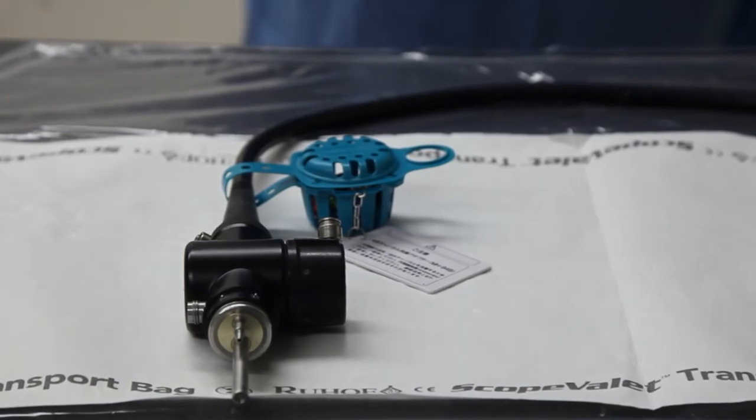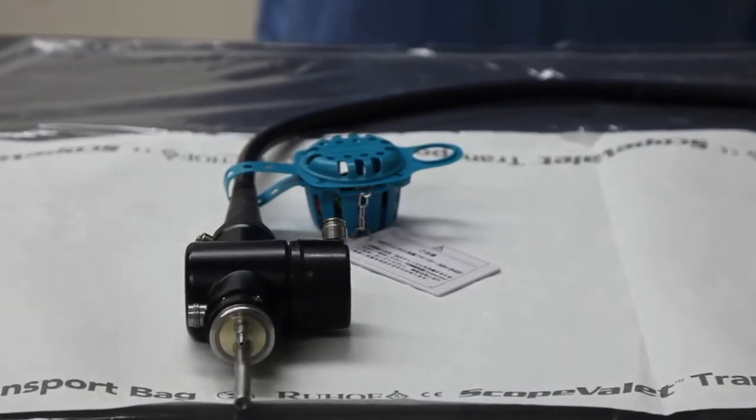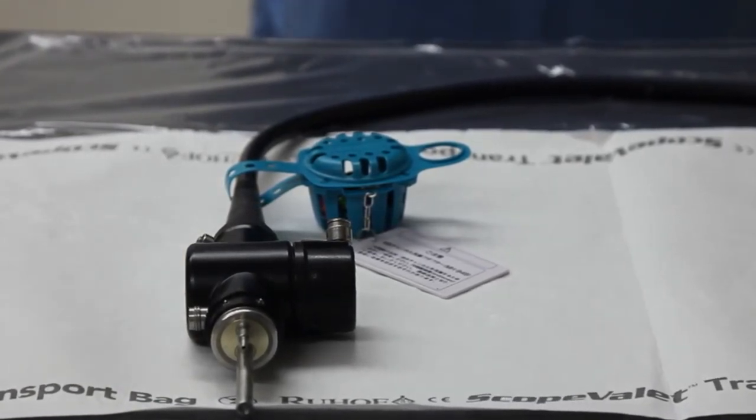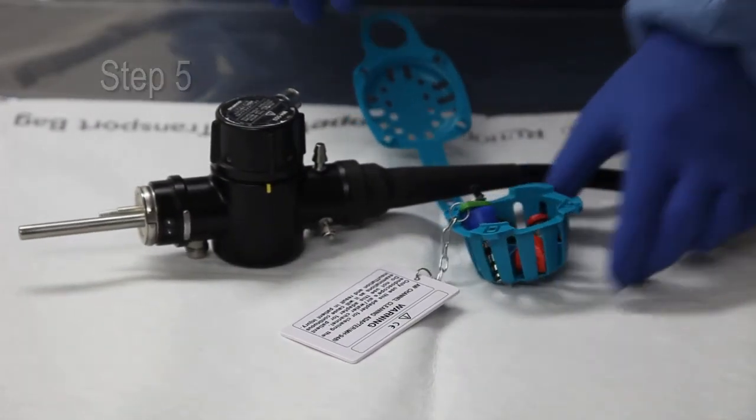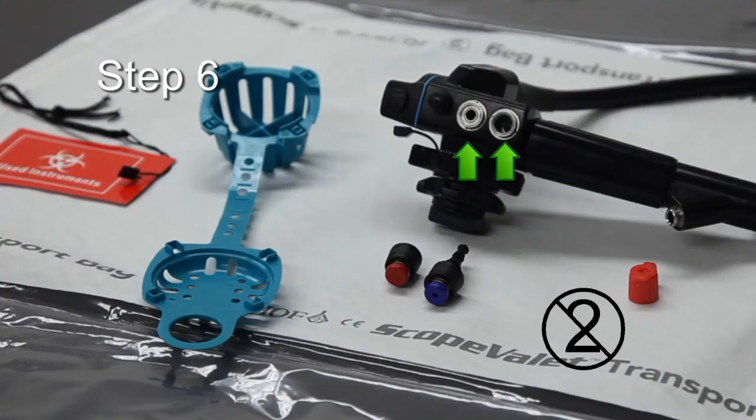Once the valves are ready to be replaced into the clean endoscope, the following steps should be taken. Pull the ring pull to open the ValveSafe so as to release the valves. Place the valves back with the endoscope. Safely discard the ValveSafe. Do not reuse.